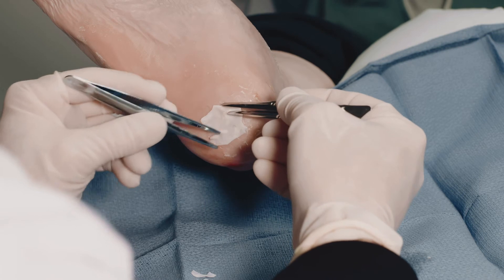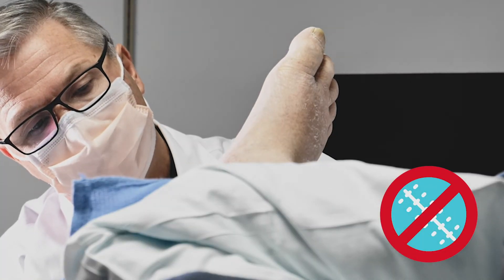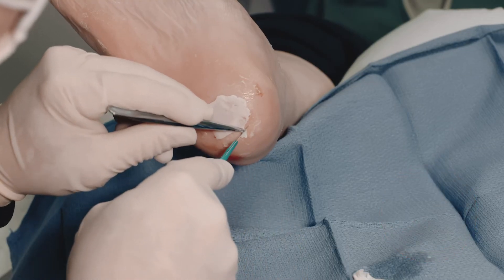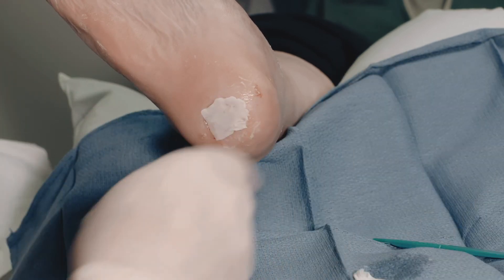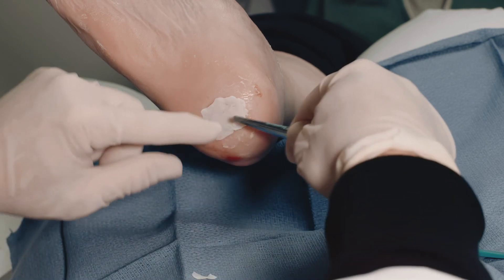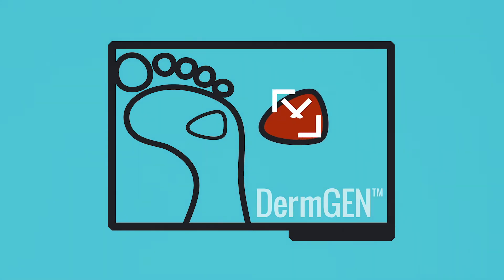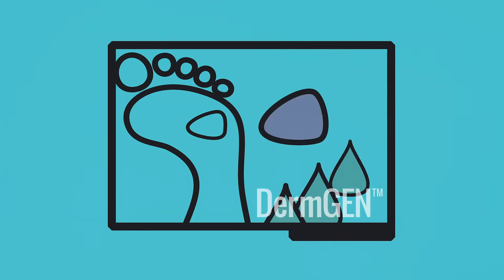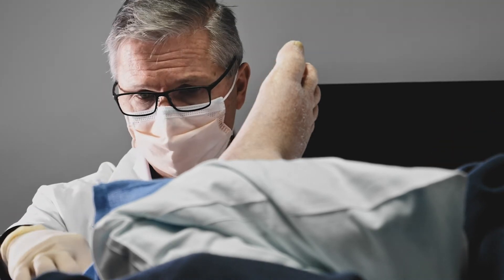You can see how the Dermagen product nicely adheres to the ulcered area. If used properly, Dermagen does not need to be secured with sutures or staples to the wound site. I'm pretty happy with that application — I think that gives us good coverage. If Dermagen does not adhere securely to the wound, the wrong surface — that is, the basement membrane side — may be in contact with the wound and should be changed to the dermal side. As a secondary check, try rinsing with sterile saline; blood on the basement membrane will not stay if rinsed.